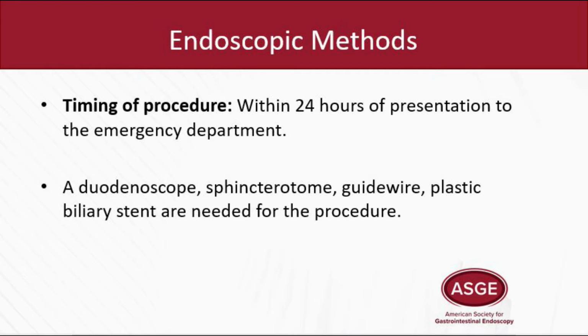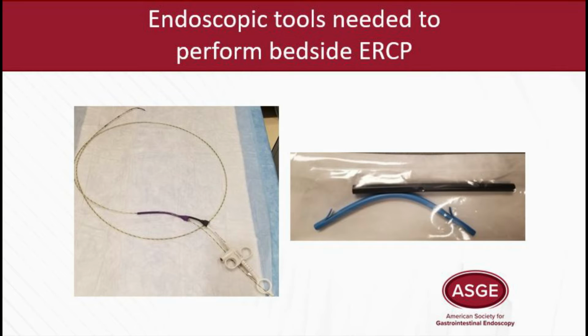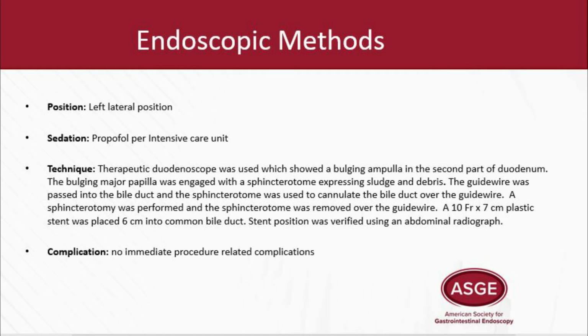ERCP was performed within 24 hours of presentation to the emergency department. A duodenoscope, sphincterotome, guide wire, and a plastic biliary stent are needed for the procedure. The patient was placed in the left lateral position. Propofol was administered for sedation per the intensive care unit.